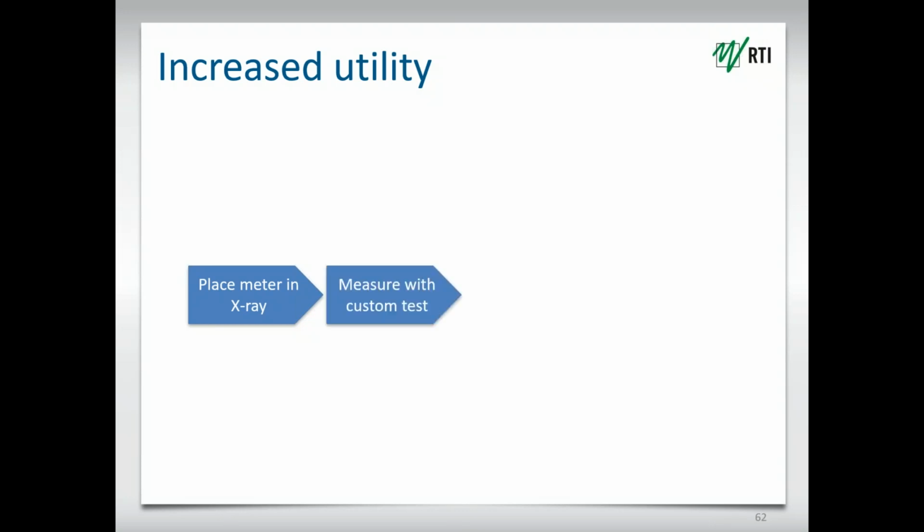So not only do we place the meter in the X-ray beam, measure it with a customized test or a sequence of tests, which the session would be a complete QA job, we generate an automatic report. That's fine, and that's what people are asking for today, more and more.